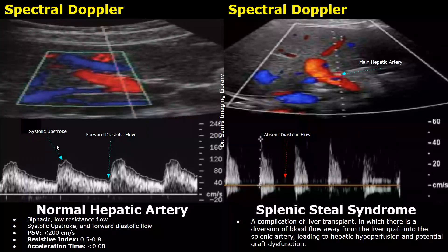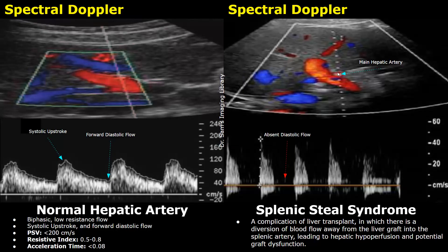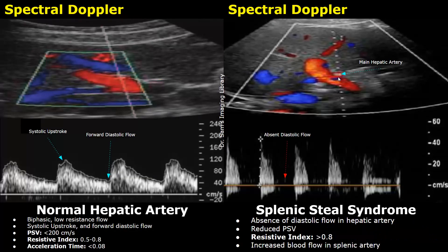We will now compare normal hepatic artery parameters with abnormal ones. Splenic steal syndrome is a complication of liver transplant. In this condition, blood flow to the hepatic artery gets diverted towards the splenic artery, so less blood goes to the liver, which can cause hepatic graft dysfunction. Splenic steal syndrome has various features seen on spectral Doppler. One of them is absence of diastolic flow in the hepatic artery, with a reduced peak systolic velocity (PSV). The PSV is only around 40 centimeters per second, whereas in normal cases it is around 120 centimeters per second.